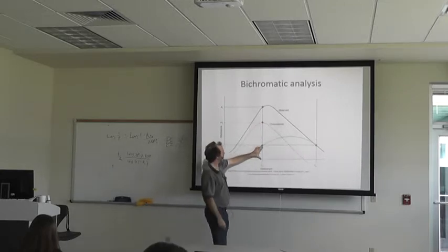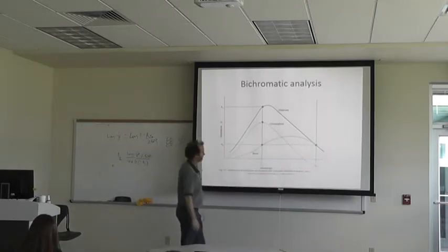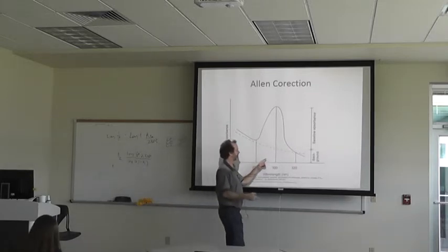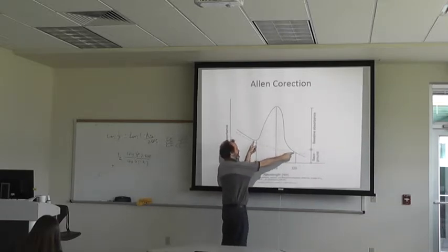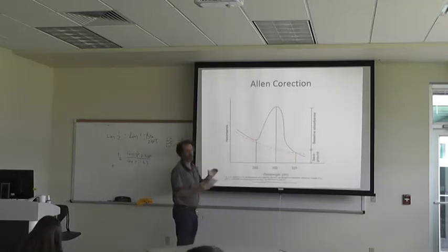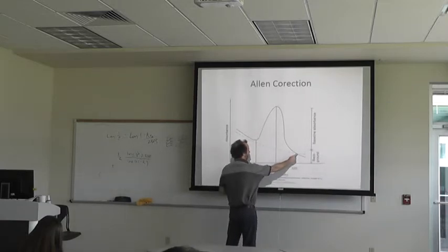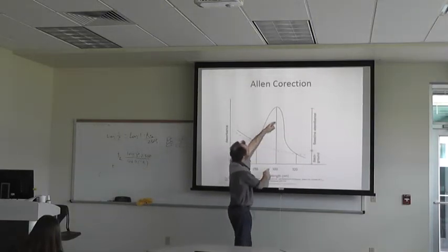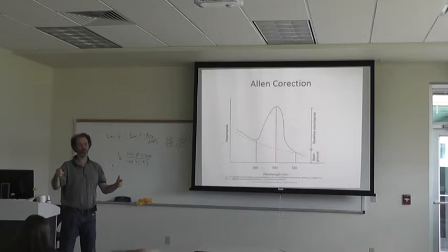A better approach is the Allen correction. You measure three points: two wavelengths surrounding the peak of interest and the peak itself. You take the average absorbance from the two flanking wavelengths and subtract it from the wavelength of interest to correct for background interferences in the sample. For example, take the absorbance at 280 nm and average it with the absorbance at 320 nm — say 2 and 1, average is 1.5 — then subtract 1.5 from the absorbance at 300 nm. Of course, we'd want to keep absorbance in the range of 0.1 to 1.0.